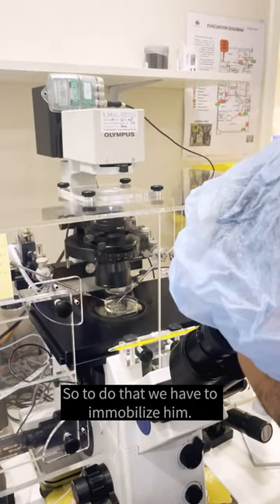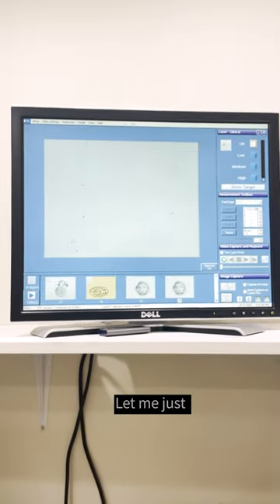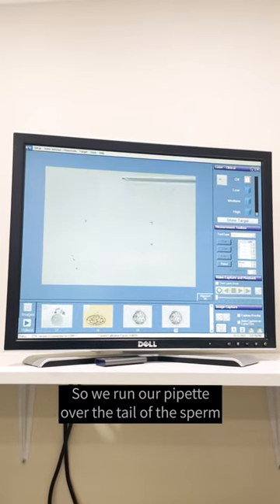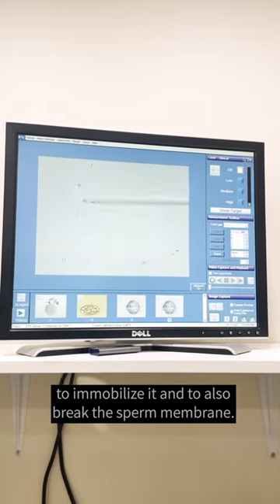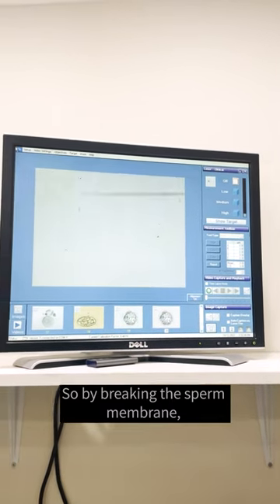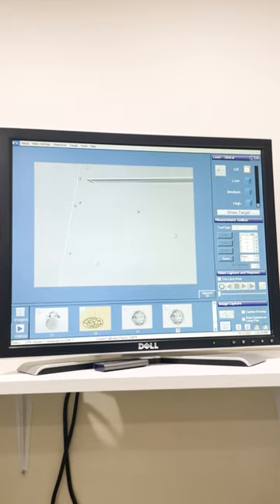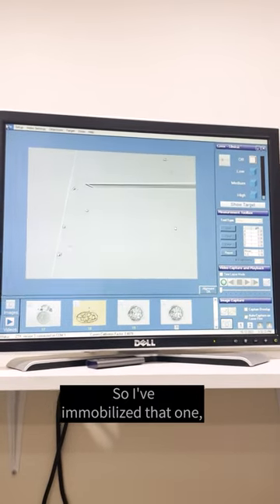We have to immobilise him. So we run a pipette over the tail of the sperm to immobilise him and to also break the sperm membrane. So by breaking the sperm membrane, when we inject it into the egg, that will allow the DNA — allow the sperm to fuse with the egg — and the DNA to be released. Can you see that?